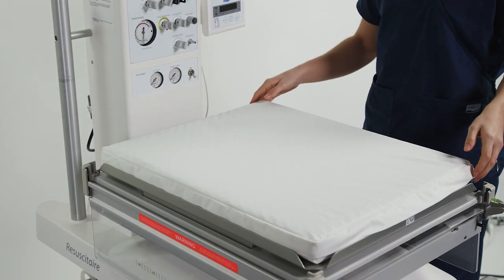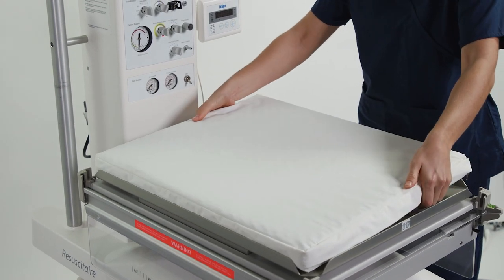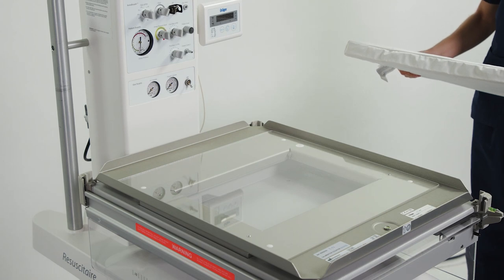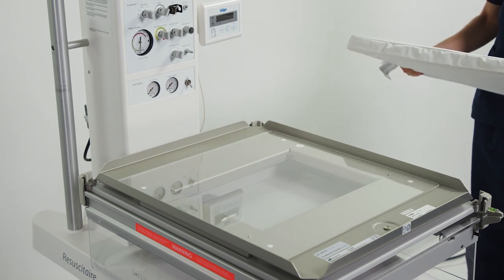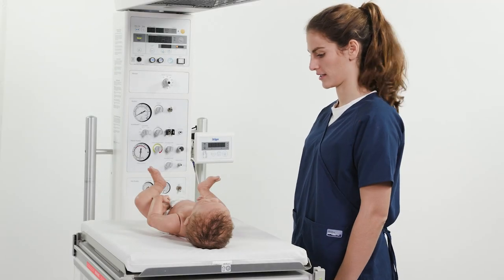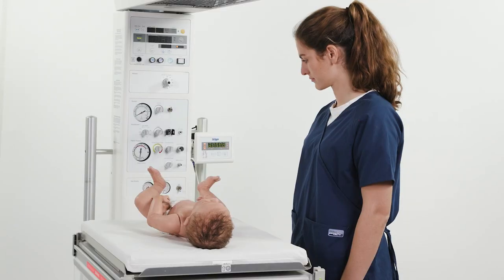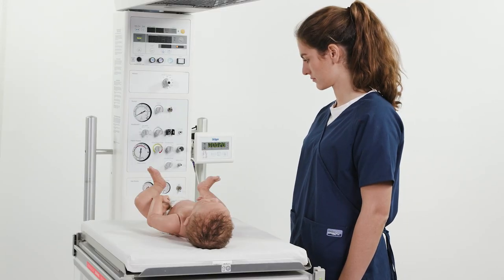The optional weighing scale offers added ease of use for the clinician by providing an integrated scale. The weighing platform is located underneath the soft bed mattress. To operate, follow the instructions for use supplied with the optional scale. The following steps should be followed.